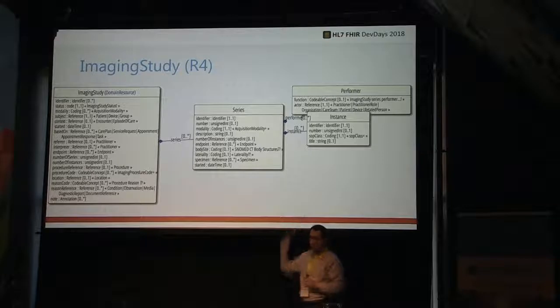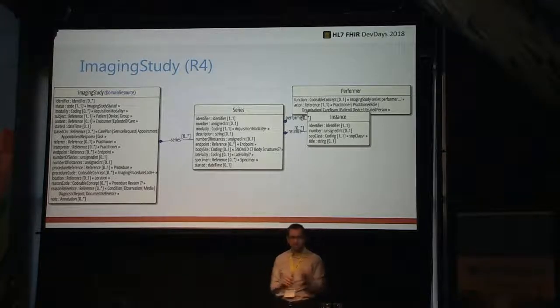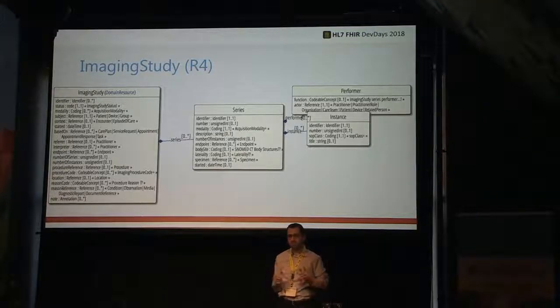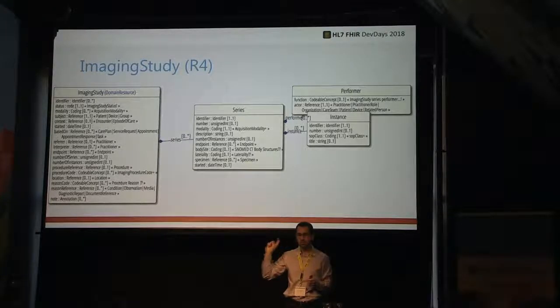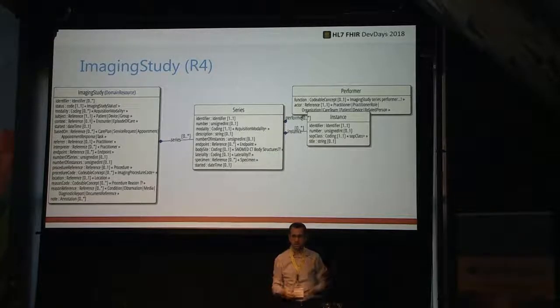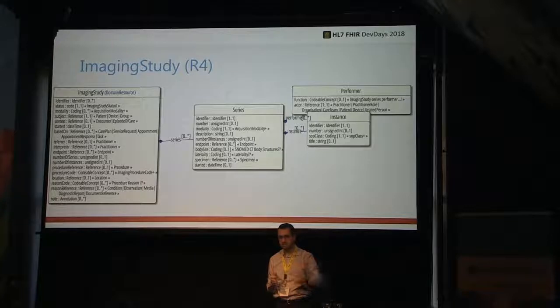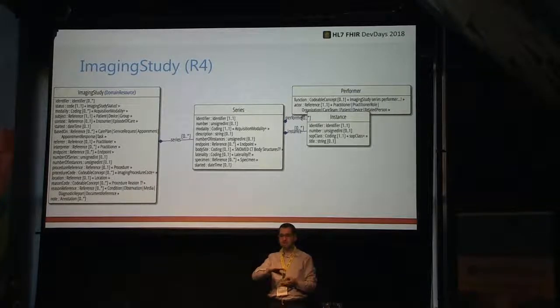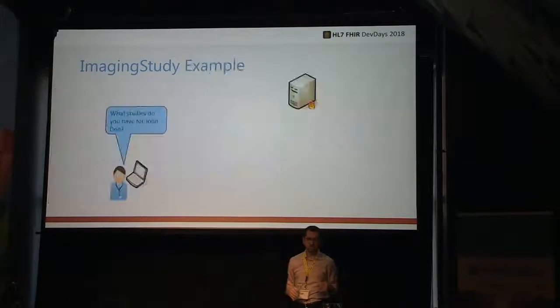One of the things people find confusing with DICOM is when you refer to that last part of the hierarchy. Sometimes you hear people calling it images, sometimes you hear people calling it instances. It, of course, depends. In a simplistic manner, you could just call it images. But in real life, they are instances because they may actually just be simple objects with metadata. They're not actually displayable objects, but they just provide you with extra information. One prime example of this is something called key object selection document. Ignore the fancy name. The function is actually very simple.